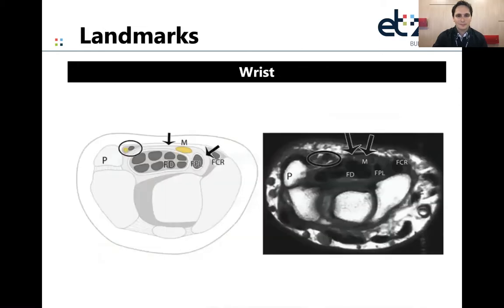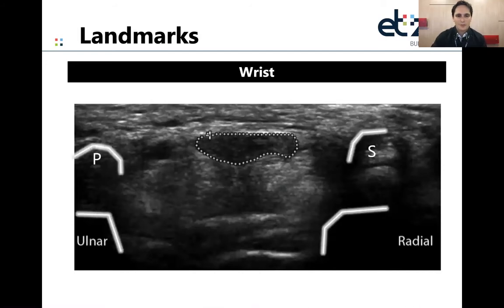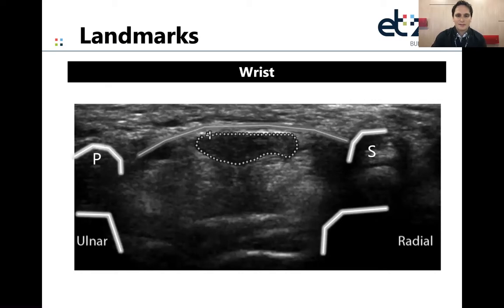When identifying the median nerve, it's important to first look at it at the wrist — the most easily visualizable place — where you can find it between the tendons of the flexor digitorum muscles and between the pisiform and scaphoid bone. Here you can see the median nerve in the middle of the screen with the two bones around it and between the tendons. The nerve is always recognizable as a honeycomb structure, and here you can also recognize the carpal ligaments.